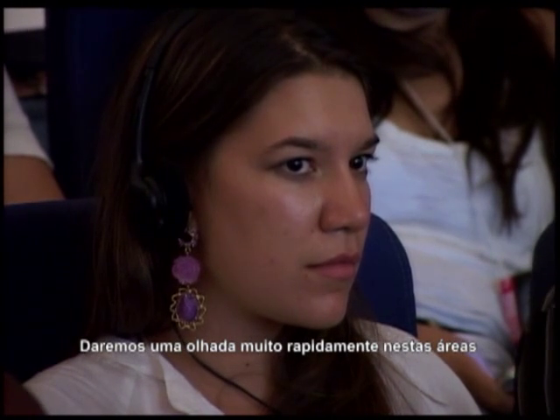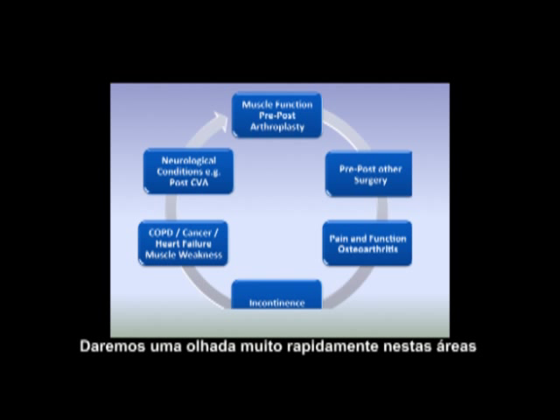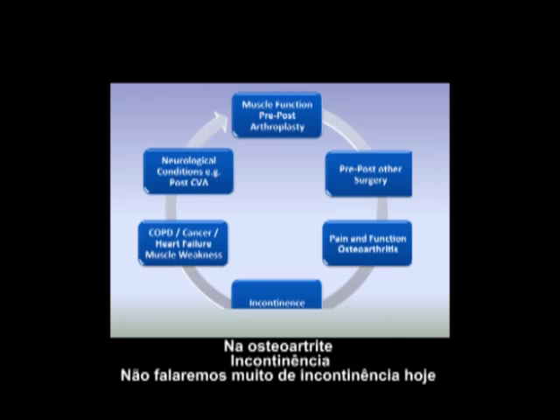So, very briefly, we'll look at these areas. Muscle stimulation after joint replacement, after arthroplasty, after other kinds of surgery, with osteoarthritis, pain, function in osteoarthritis, incontinence. We were not doing much on incontinence today.